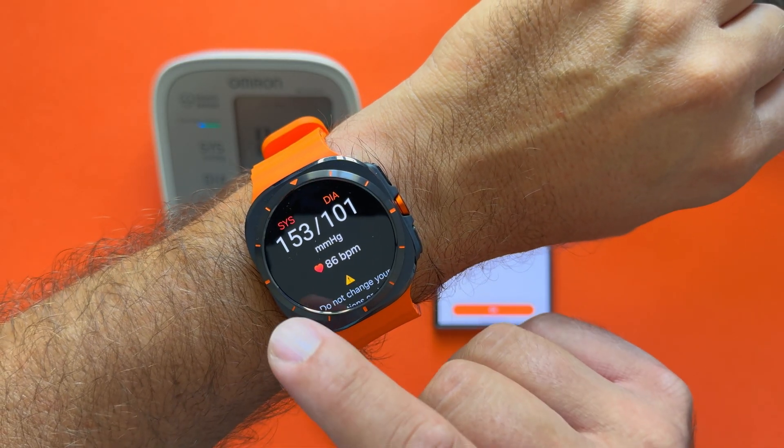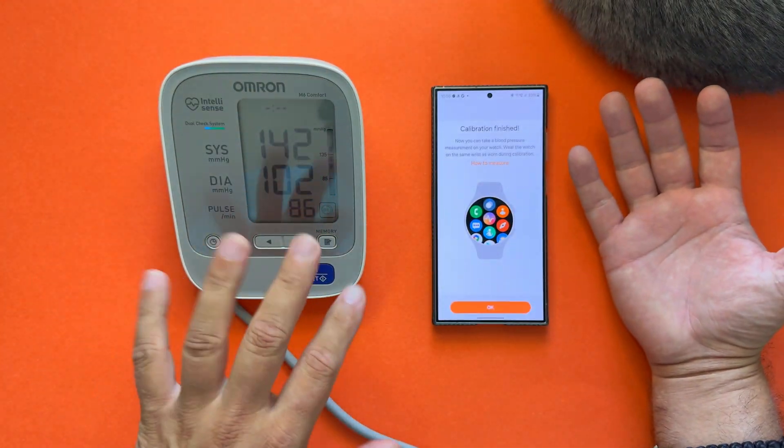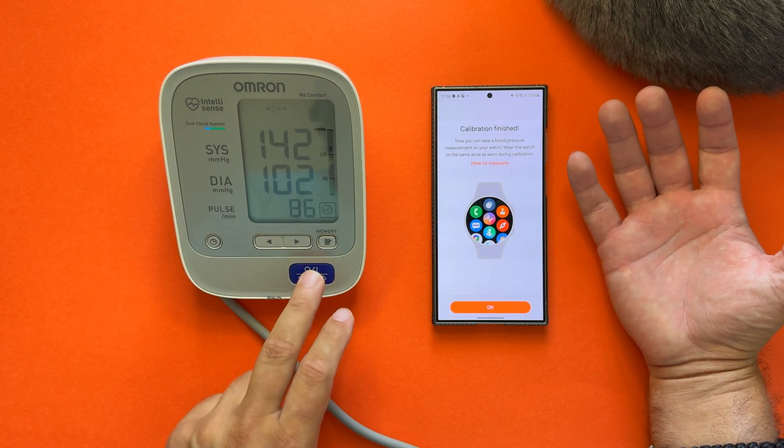All right, the watch is reporting 153 over 101 with 86 BPM. This is the pulse. And now I'm going to repeat the same but with the blood pressure monitor.